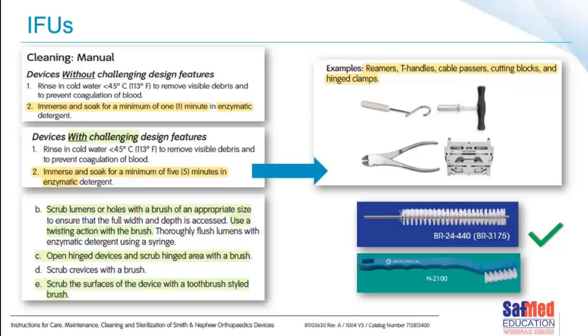So we were giving some advice to a particular company, and as a result, we got to learn these very detailed instructions for use. This is the same set that we spoke about earlier, going deeper into the document. They divided into devices without challenging design features and devices with challenging design features. And the instructions are slightly different for the two different types of instruments. Again, the complexity of the instrument matters here.